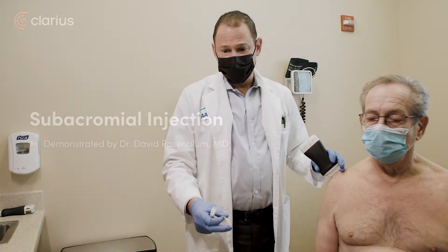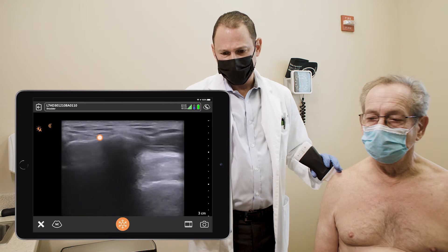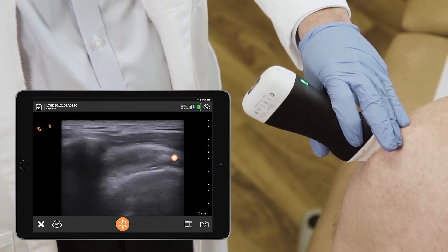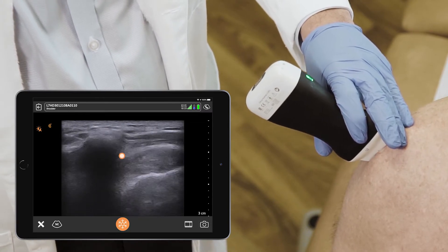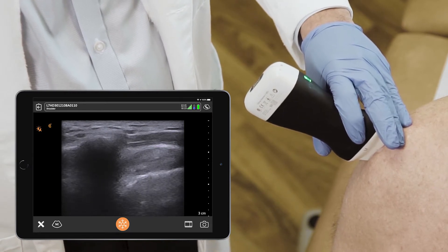We're going to perform a subacromial injection. What we visualize here is the acromion bone and the supraspinatus tendon as it comes out to the humerus laterally. The space between the tendon and the deltoid is called the subdeltoid bursa, which is not very visible as the patient does not have much fluid in the bursa — just a thin black line.